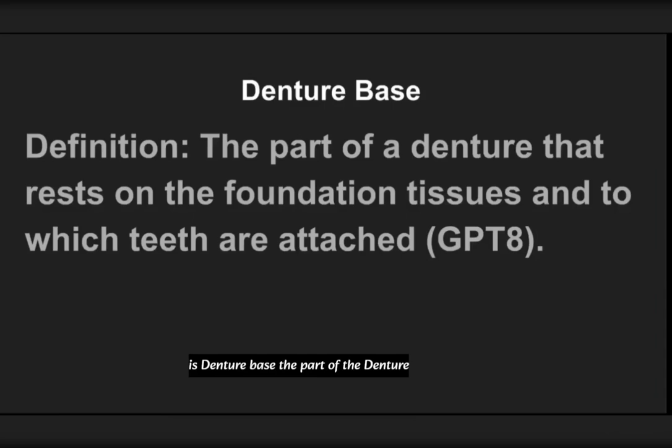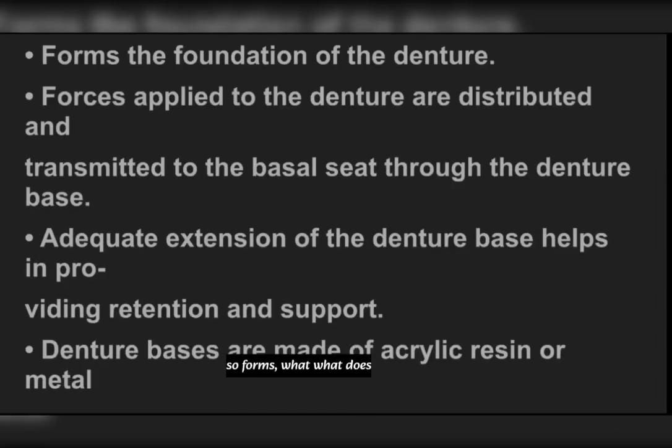The part of the denture that rests on the foundation tissues and to which teeth are attached. It forms the foundation of the denture. Forces applied to the denture are distributed and transmitted to the basal seat through the denture base. Adequate extension of the denture base helps in providing retention and support.